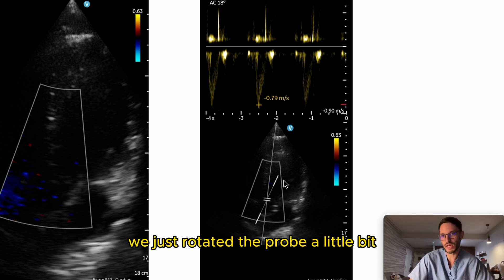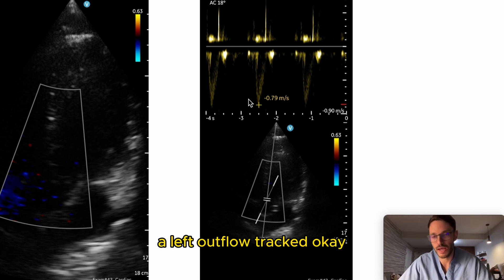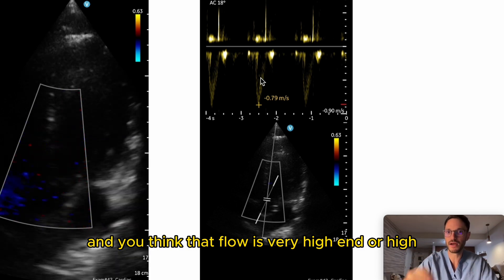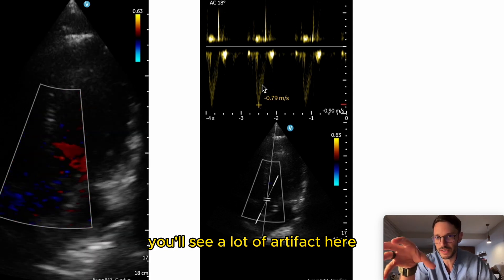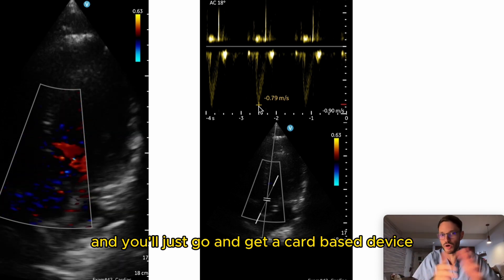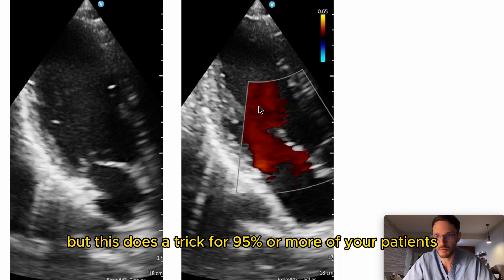Here we have apical four-chamber with the probe rotated slightly, measuring the max velocity out of the left ventricular outflow tract. If you need continuous wave and suspect elevated flow, you'll see aliasing artifact — that signals the limitation and you'd go get a cart-based device. But pulse wave does the trick for 95% or more of your patients.